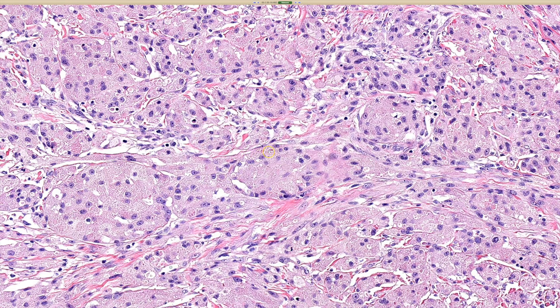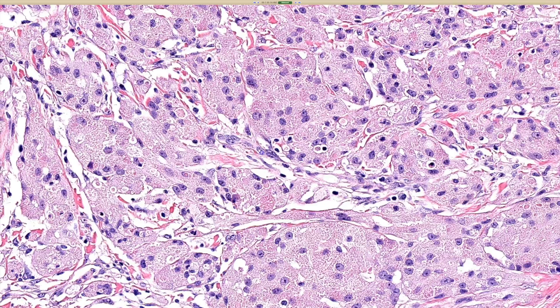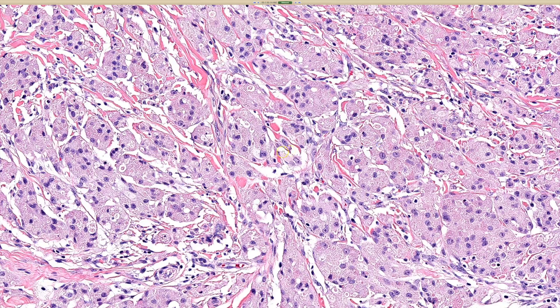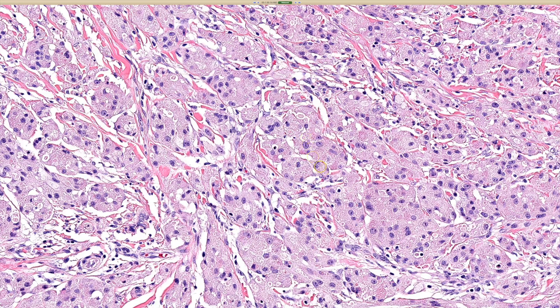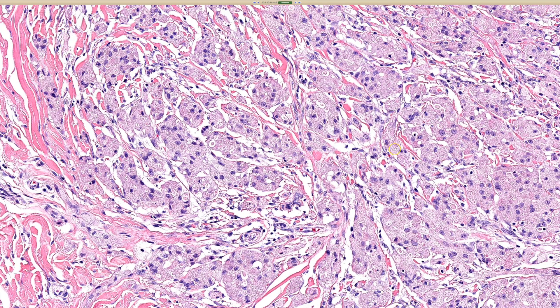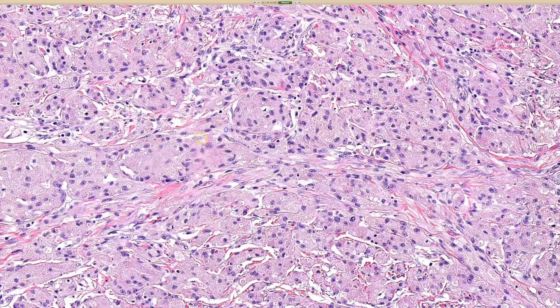They also have granular globules in their cytoplasm called pustulo-ovoid bodies of Milion, if you want to get fancy with eponyms. The cells usually have round nuclei, central punctate nucleoli, and low mitotic activity. They may have random pleomorphism — that's okay, just like neurofibromas, schwannomas, and other nerve sheath tumors. Nerve sheath tumors in general can have scattered degenerative-type nuclear atypia with minimal mitoses.